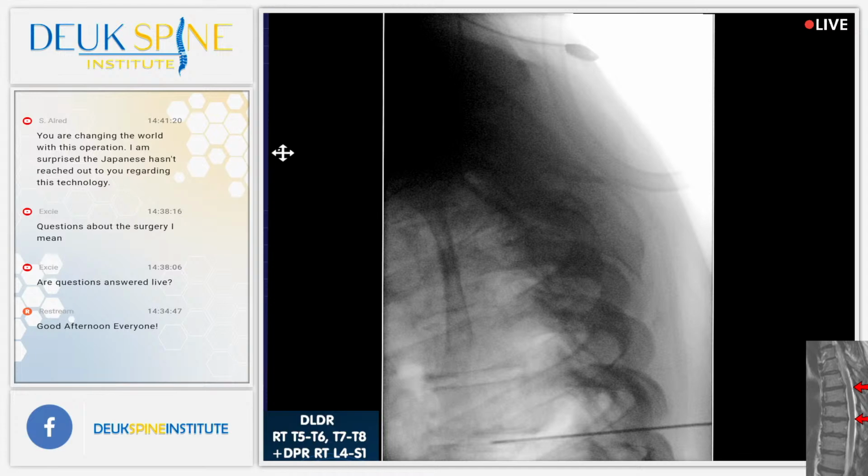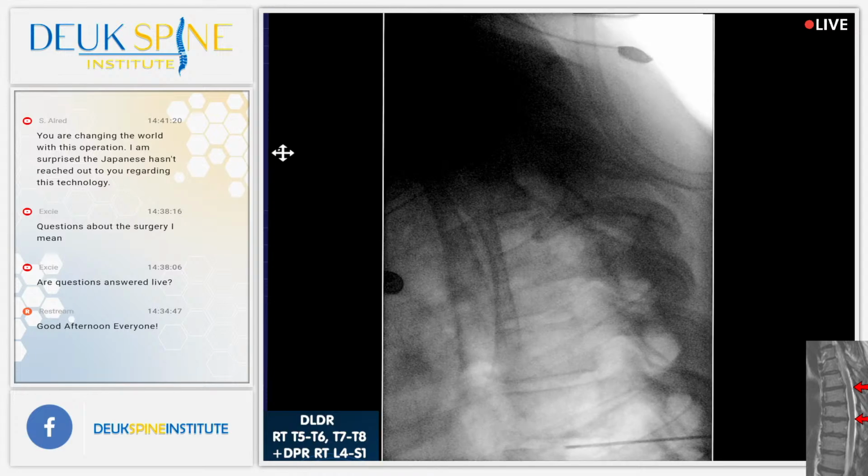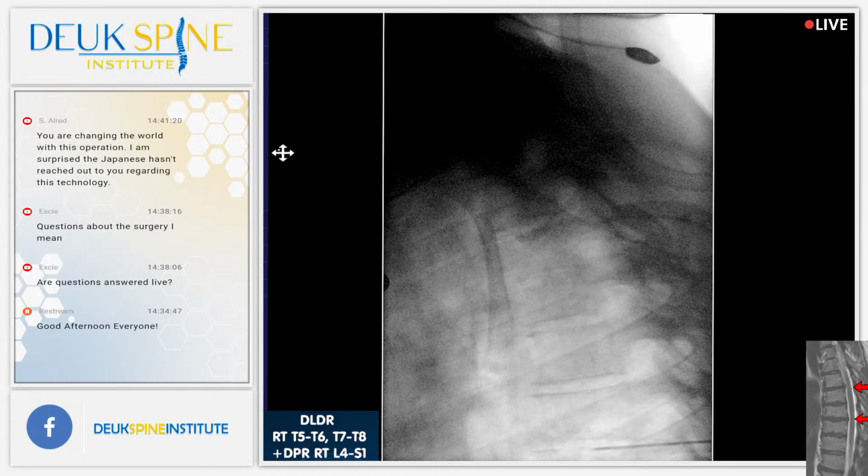What we're doing, folks, as you're watching, is we are getting the disc lined up properly with the fluoro. And here's why. The fluoro is what guides us. If the fluoro information is wrong, we will never get to the disc. I think you're off on orbit, but you definitely got a good wag. Your wag was much better. You're not far off on orbit either, I don't think. Hey, that's pretty darn good right there, Jordan. Yeah, that's really good. All right, show us the 7, 8 disc.